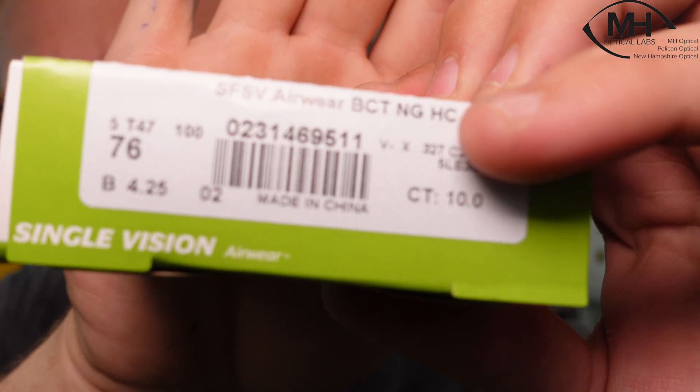To start the conversation about hard coated lenses, we have to start from the lens blanks itself. Not all lens blanks come with a hard coating. For example, that little 'HC' marking is representative that that lens has a hard coating.